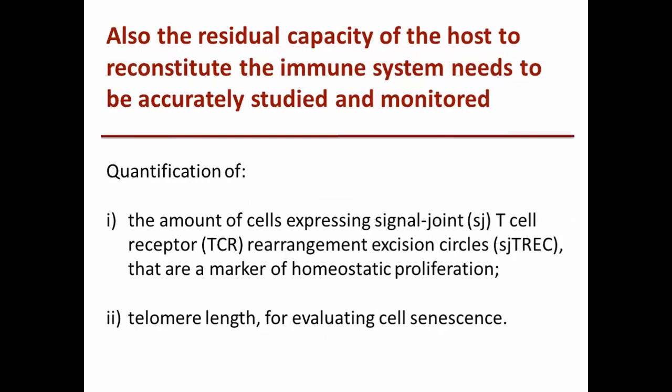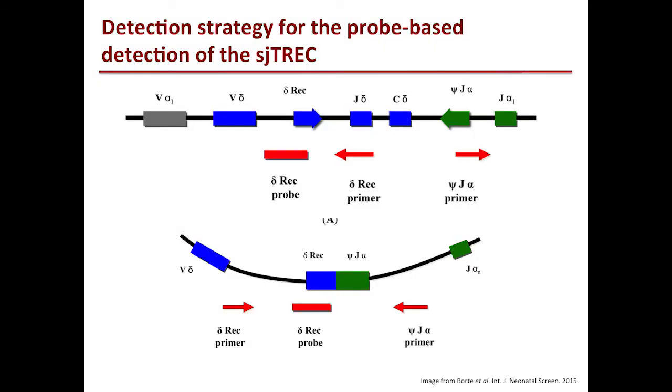Then we took a look at the immune system, not only at the virus, but we quantified cells positive for TREC and telomere length to evaluate cell senescence.